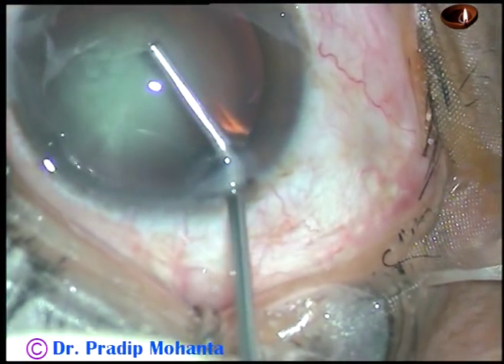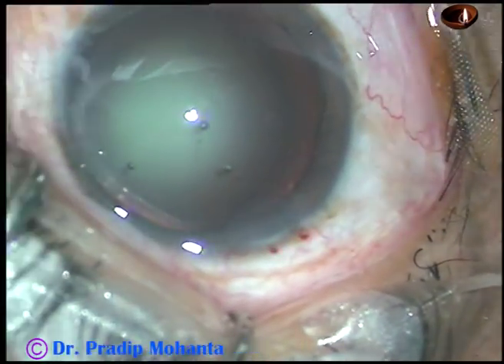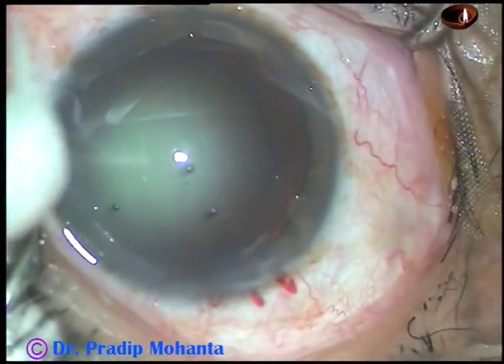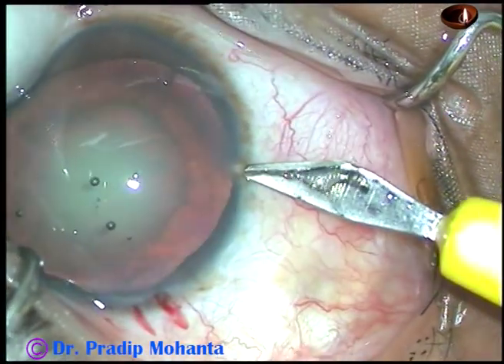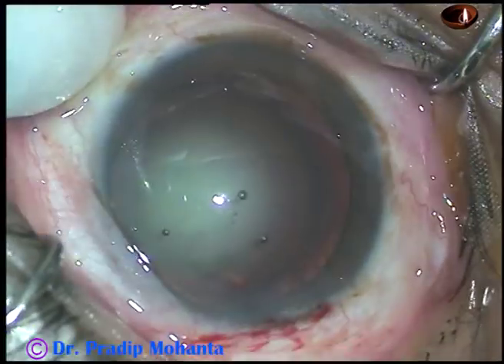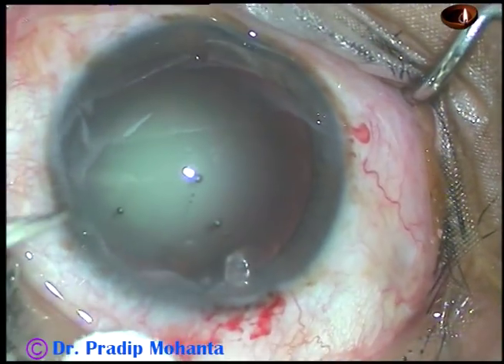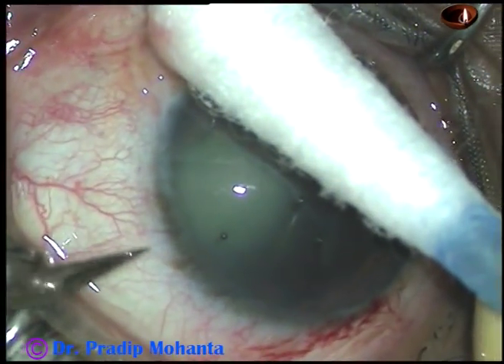By this time, the main incision has been made. Viscoelastic substance has been injected into the anterior chamber. Now I am going to do two paracenteses. This is the paracentesis on the right side, and this is another paracentesis on the left side.